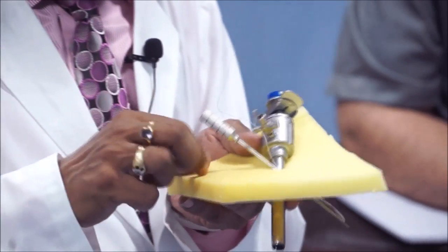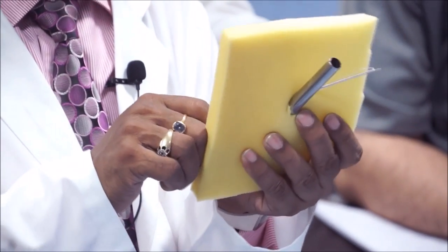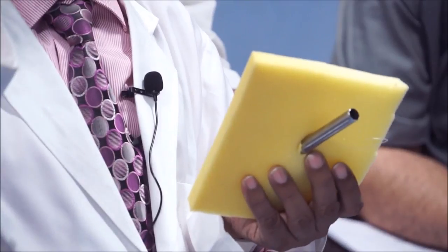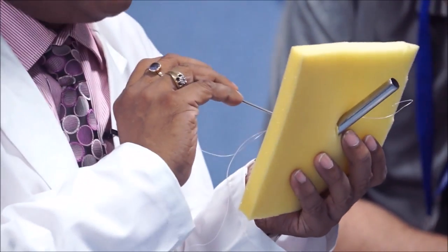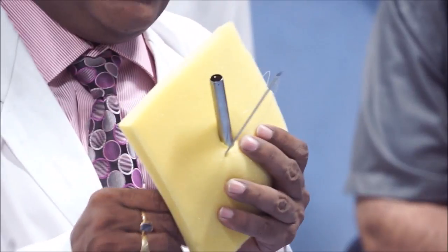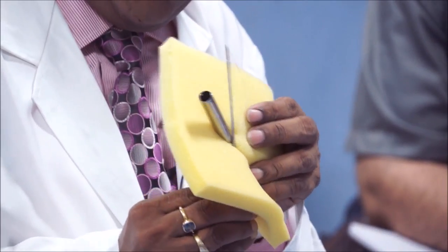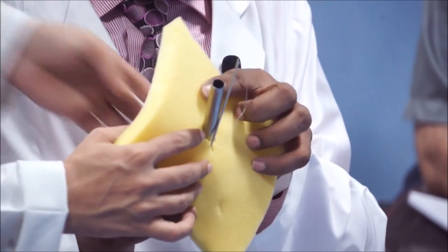And once it is in, then put the finger over the longer thread and then pull this out. And it is out. But this thread is already in. Then you go from the other side and then you go in, and as soon as you pull it, see, can you see a loop is forming? And just entangle this suture in the loop and it is done. As soon as it is entangled, sometimes you may take it out also.